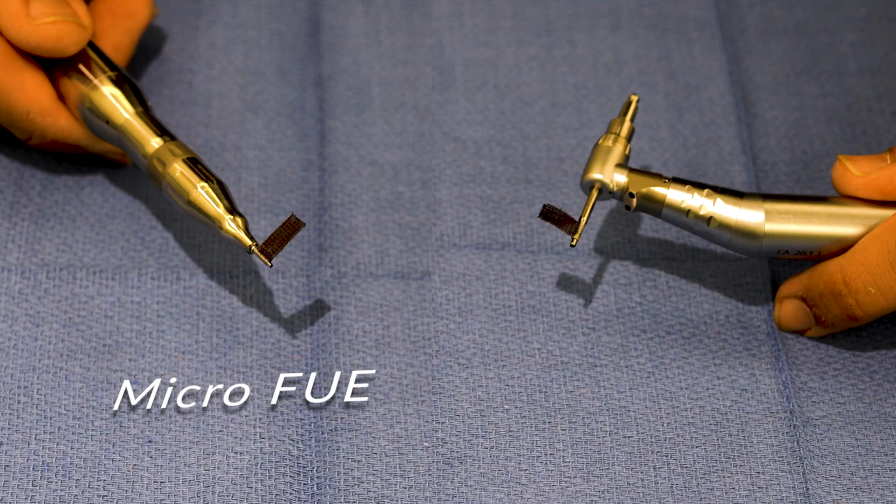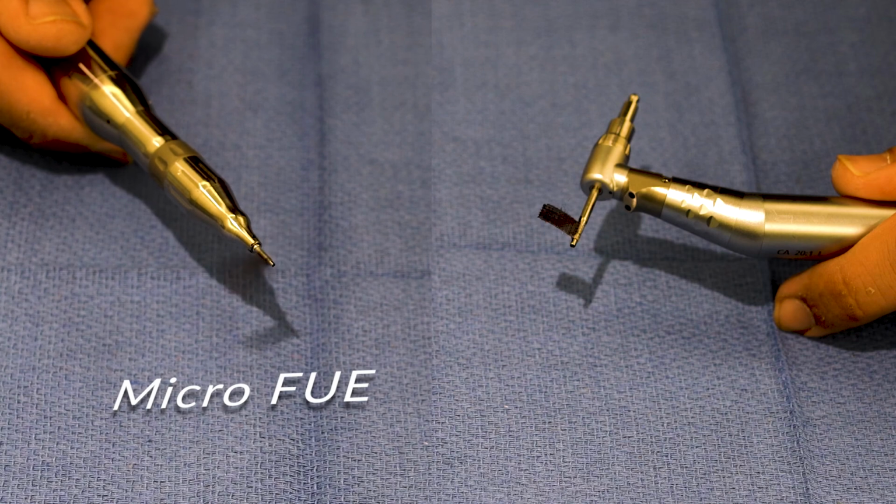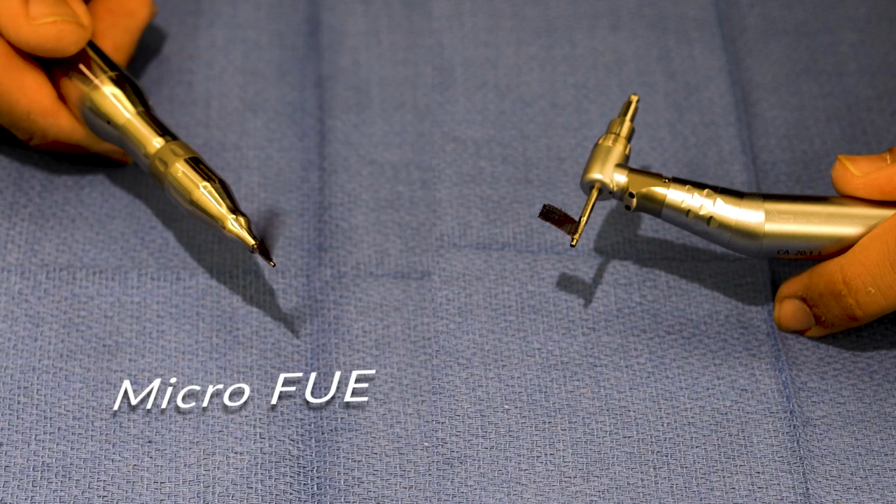The micro device is different. It has a smooth notch blade, which means that it's going to start with rotational mode where that notch is going to cut through the skin, and then it's going to switch into the vibration suction mode where it's going to suck the hair up and vibrate down the shaft to make sure that it doesn't injure the hair shaft, the glands, or the follicle as it's taking them out. So let's go ahead and see these things in action on Jamie.